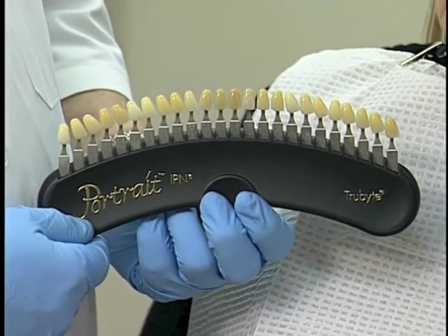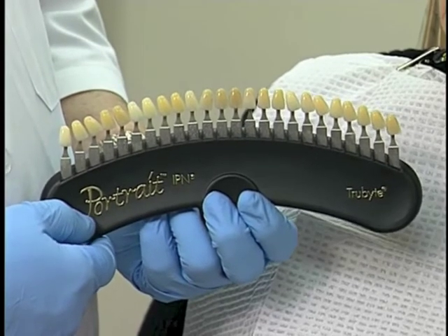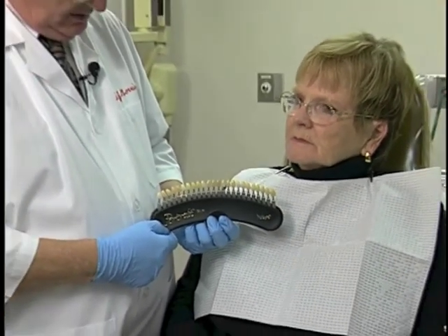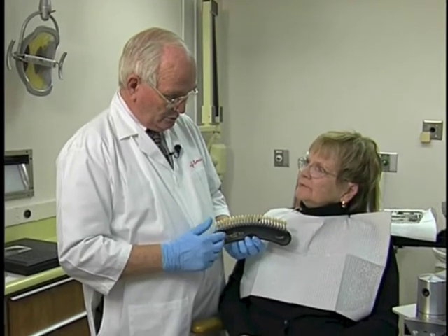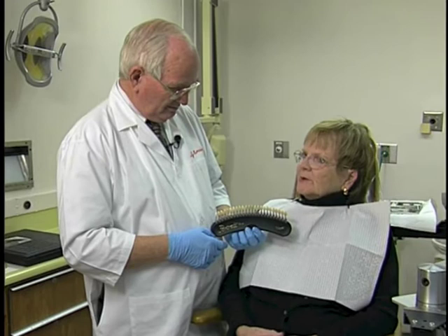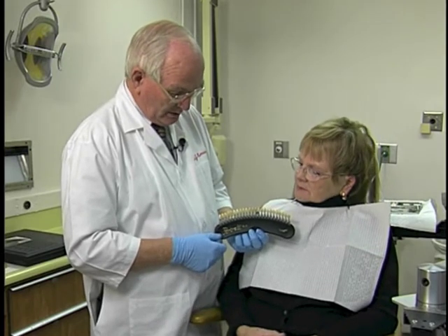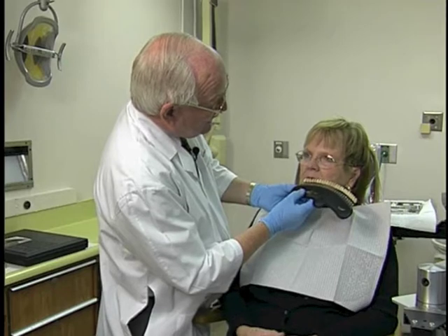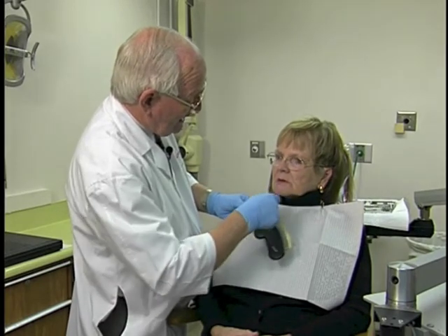Now that we've selected the mold, we need to select the color of teeth. I start by asking the patient how she liked the color of her old dentures. She says she'd like them a little bit whiter and more translucent throughout the whole tooth. That leads us toward needing a little more gray in the tooth than the original. So let's look at the shade guide — this tooth might fit the bill, and that tooth might fit the bill. Let's see which we like best.